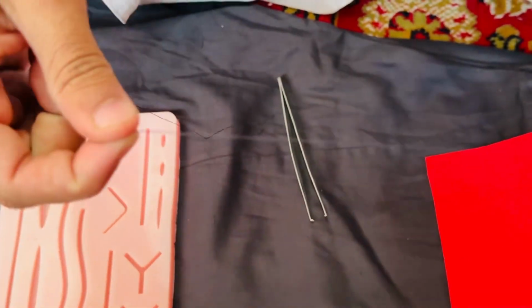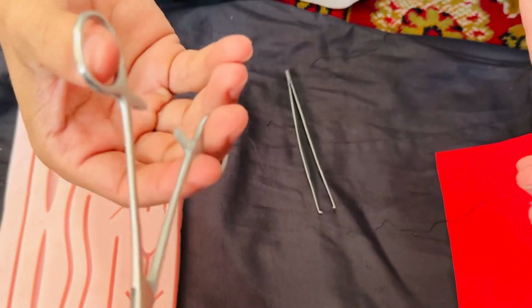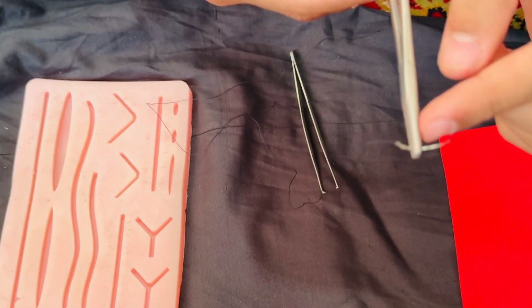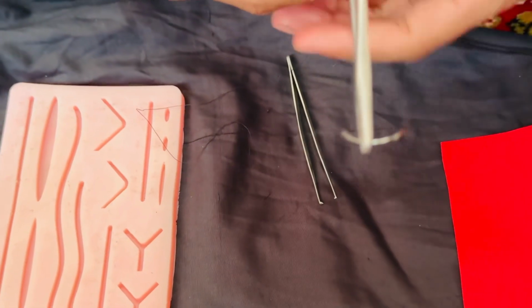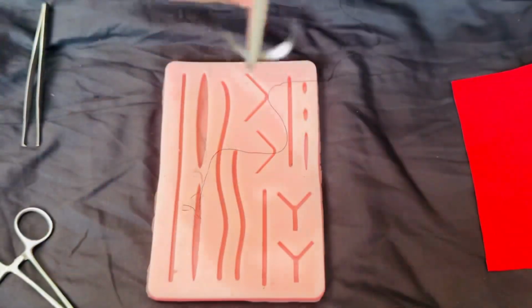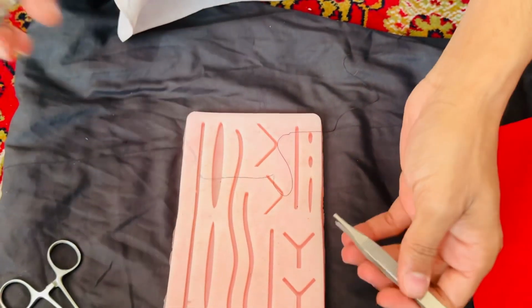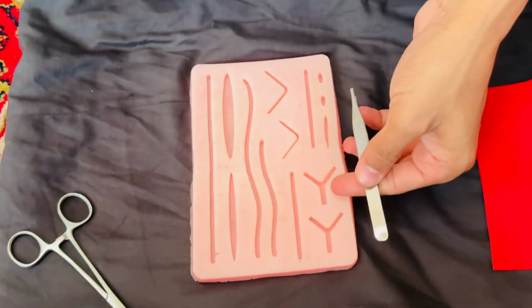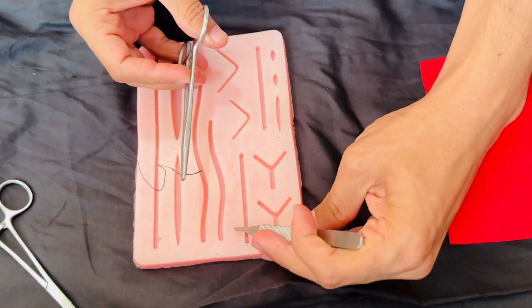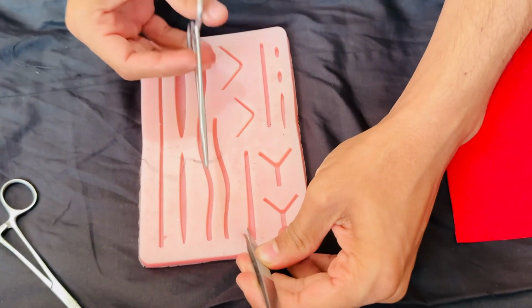Now let me tell you the procedure. So for this, hold the needle in your left hand and the artery forceps in your right hand. Grasp the needle from 2/3 of its tip with the artery forceps and lock it by this mechanism or this way. Now to perform the interrupted suture, you need to begin by threading the suture material through the needle holder and inserting the needle into the tissues on one side of the wound.